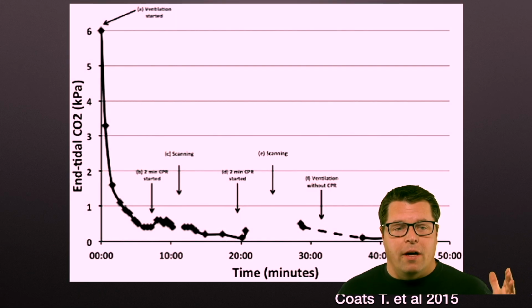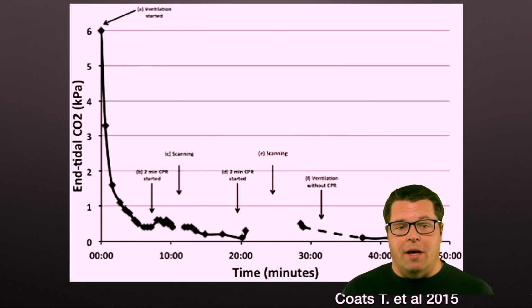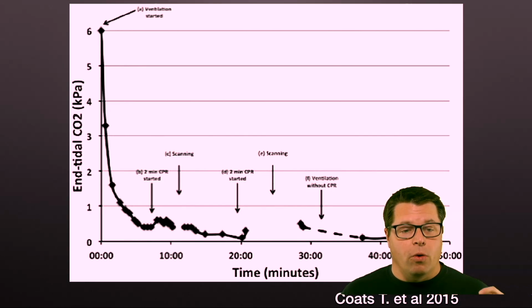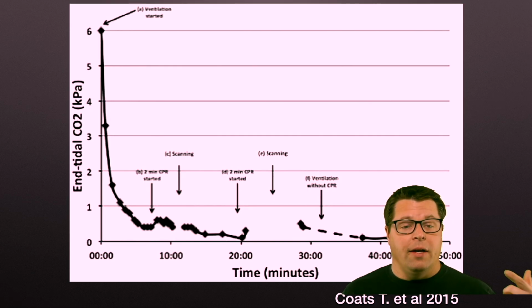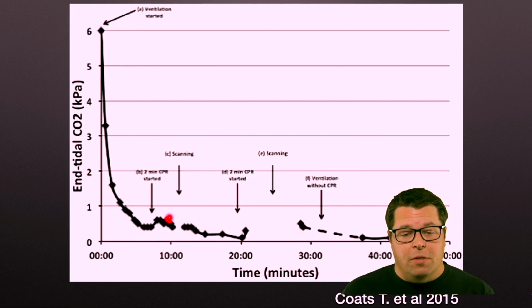If you have a tube in the right spot, it will make an end tidal CO2 waveform and give you a reading almost all the time. And this is proof. This is what happens when you do it to a cadaver that had been stored at freezing temperature for 32 hours and then taken out, intubated, and started ventilating. When you start ventilating this cadaver, someone that is clearly dead, you do get an end tidal CO2 waveform. Now we'll talk about what an end tidal CO2 waveform means later. But after you start doing some CPR on it, you do generate end tidal CO2.